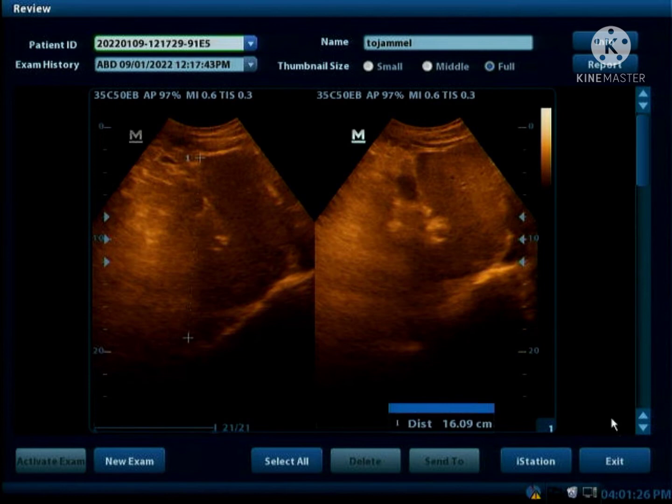Here the liver is severely hyperechoic, the lower border is not seen, and the liver vessels are not well seen, so this is a Grade 3 fatty liver.